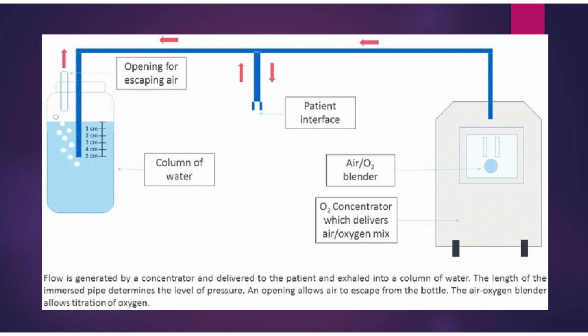But I think what is really key, two of the things that you've said, is checking your concentrators regularly. How much oxygen are they producing? Again, in Mbale, we're not very good. We check once a month, but I think most people can do better than us, but we at least know the percentage of oxygen that's coming out of that concentrator.